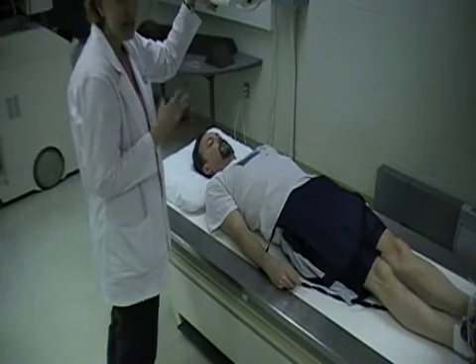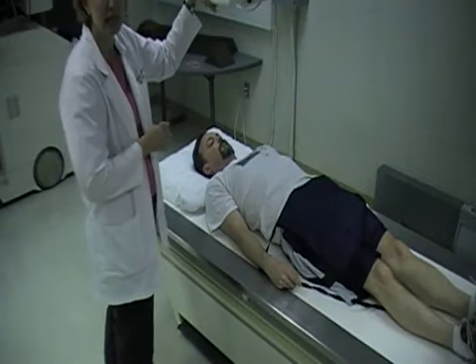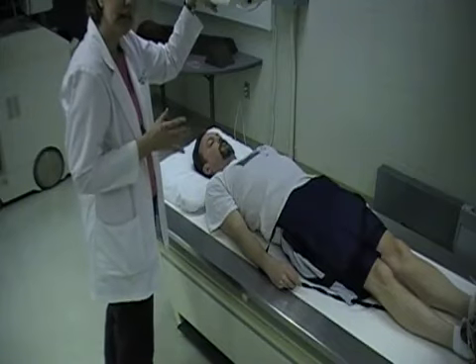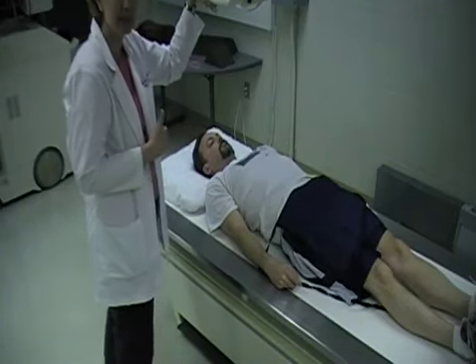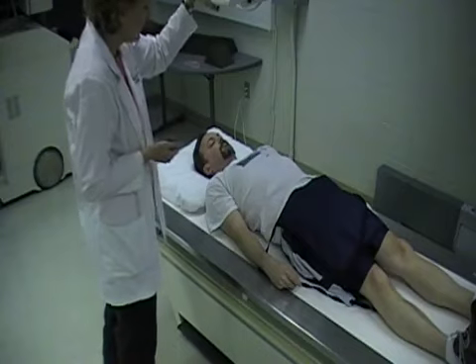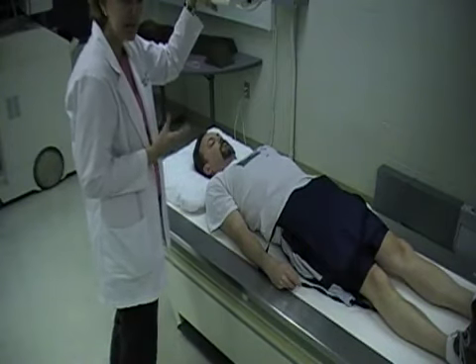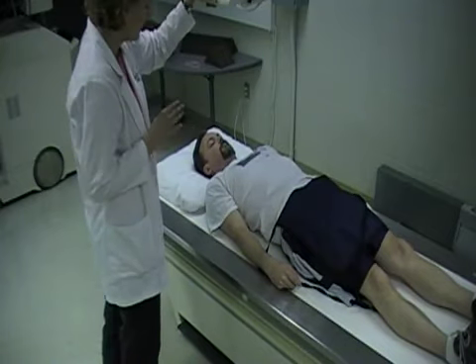Usually for an upper GI there is a scout film involved, so you would just simply take a KUB, and some radiologists like a high KUB so you can see all the way up to the diaphragm, since the stomach is right below the diaphragm. But again, you'll go with the protocol of the facility. Now, once the patient has drank their barium, the radiologist has taken his image under the fluoroscopy unit.